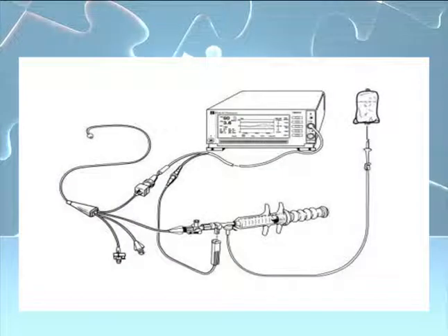And this is what the whole setup looks like. You can see this is the syringe, it's hooked up to a bag of saline, and then there's your Swan.